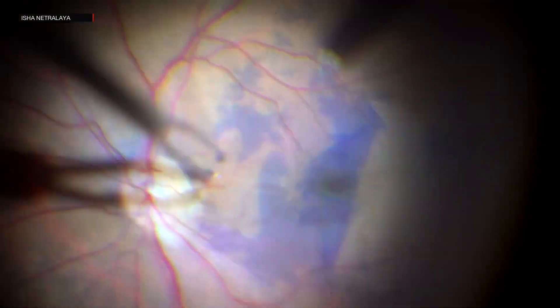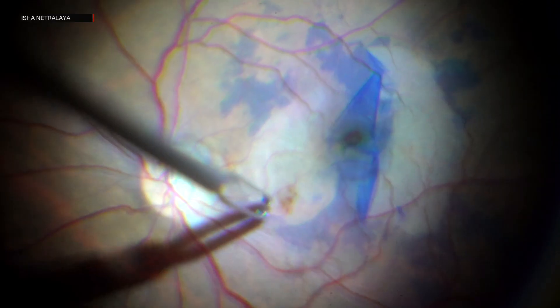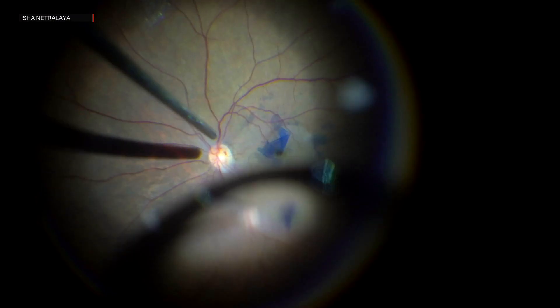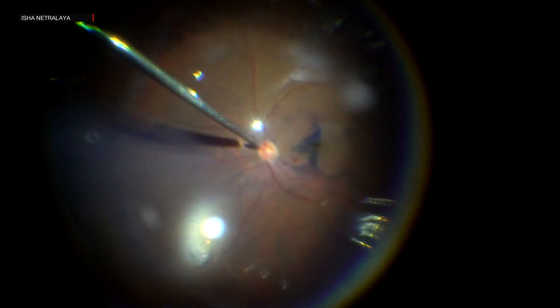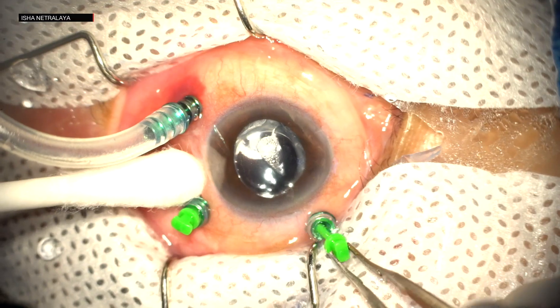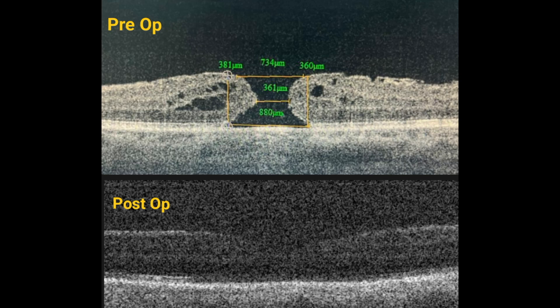The remaining nasal ILM was then peeled. Fluid-air exchange was done and the case was closed under gas tamponade. Here are the pre- and post-op OCT images. The best corrected visual acuity was improved to 6/12 at one month follow-up.